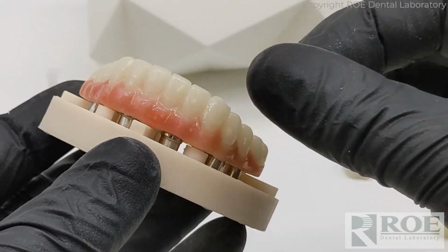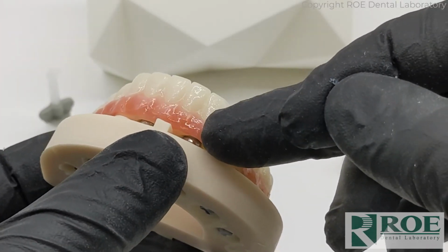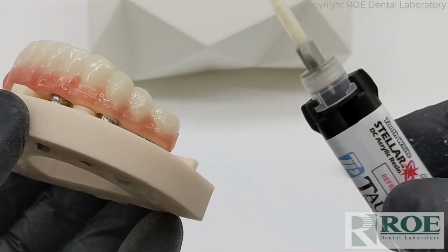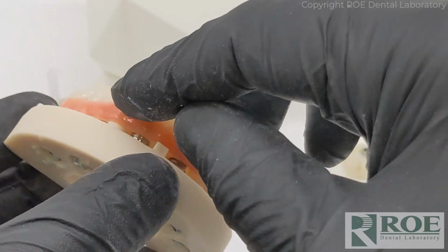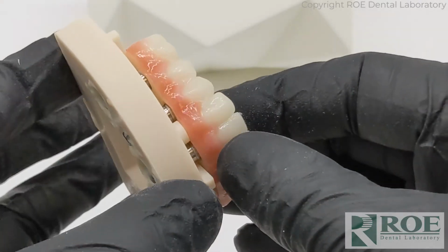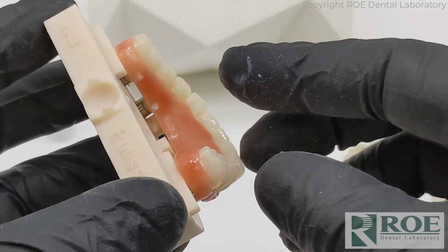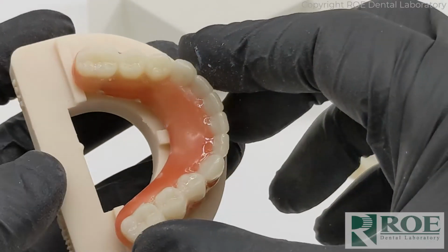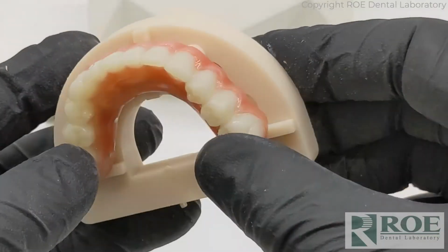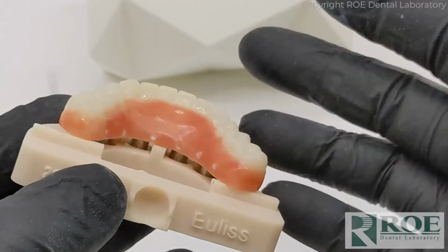Now, one more thing to remember is that when you do take this off, you'll probably have some voids around those Smileloc copings, and you'll just simply use some Stellar material, and you'll carefully backfill. You don't want to get any material in the coping, but backfill around each coping until it's nice and finished, and then use a burr to adjust any excess material, and then you can adjust the lingual if you wish it to be a little bit narrower. You can adjust some of the buccal flange, the area up here too if you wish. But otherwise, it's a simple process of just cleaning this up, adjusting a little bit, and delivering it to the mouth.